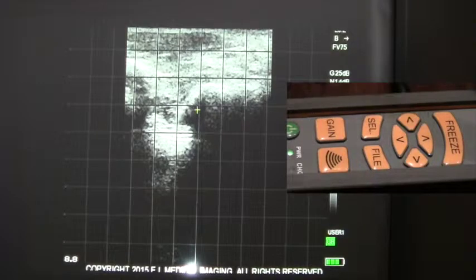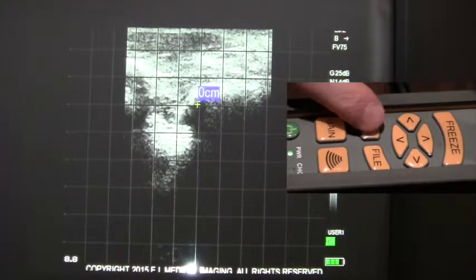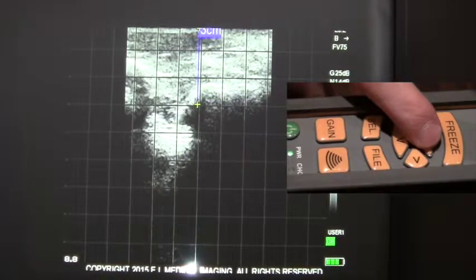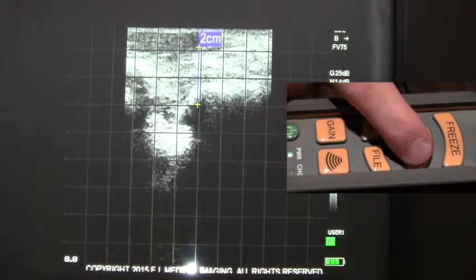Use the arrow keys to move your first caliper, press select to set, use the arrow keys then to adjust your second caliper.